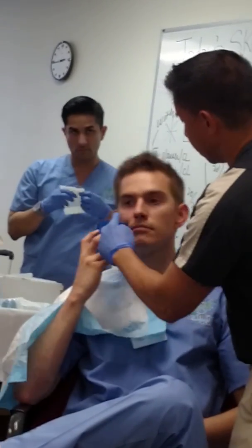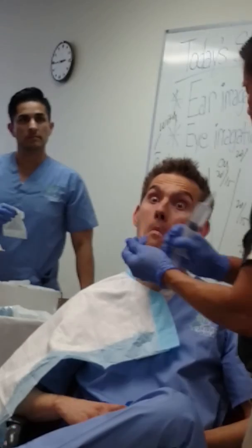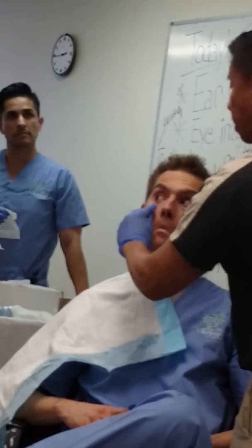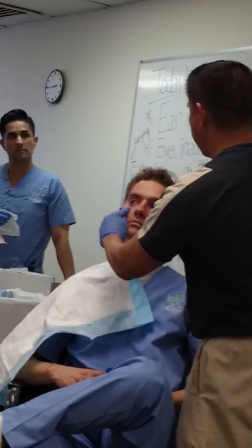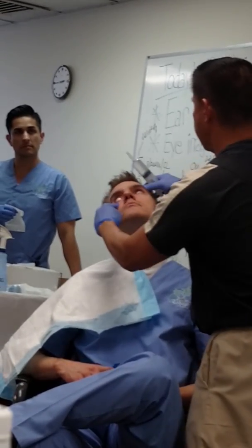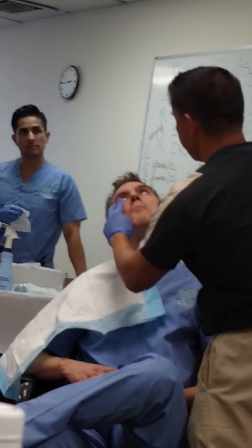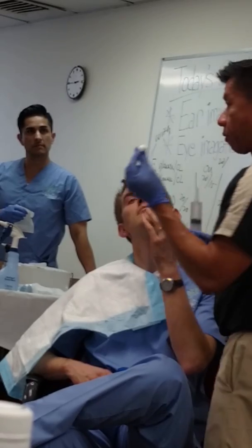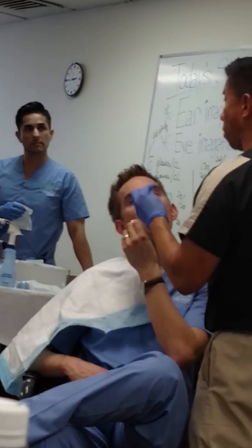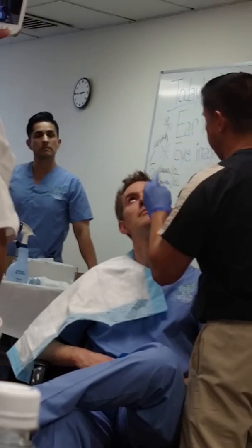Let me show them. This is the lower eyelid or the conjunctiva. Have the patient look up, and what you'll be doing is, again, towards the affected eye, and you will give the patient a cotton ball or 2x2 or 4x4 gauze to wash for any excess water. You will instruct the patient, I want you to just look up, stare at the.